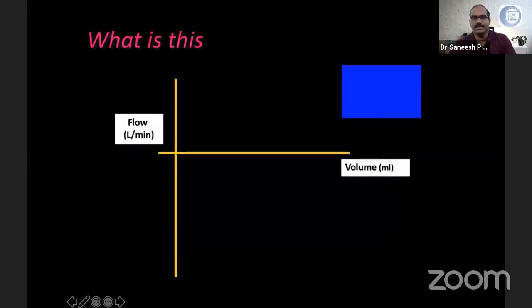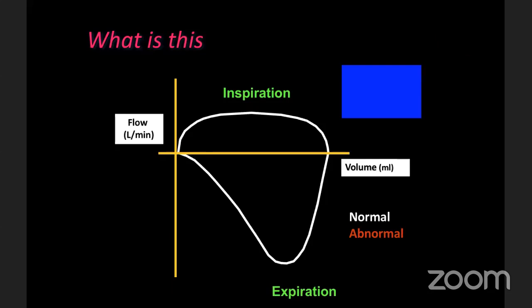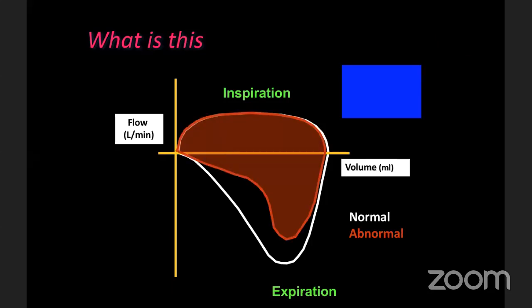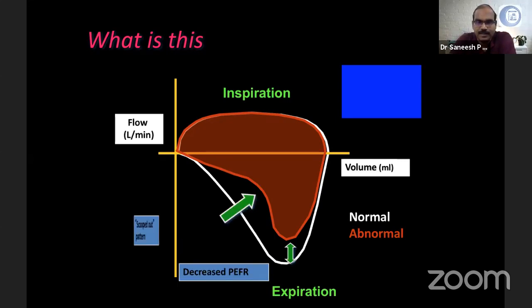This we have discussed, and this one is flow versus volume, the flow volume loop. Dr. Lakshmi Narayan, you can comment on that.